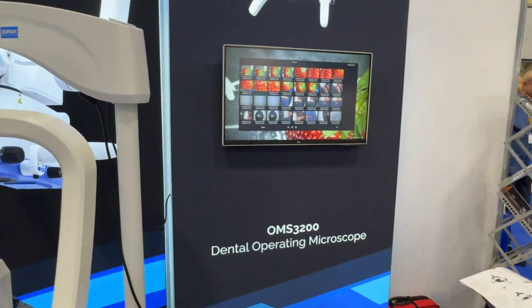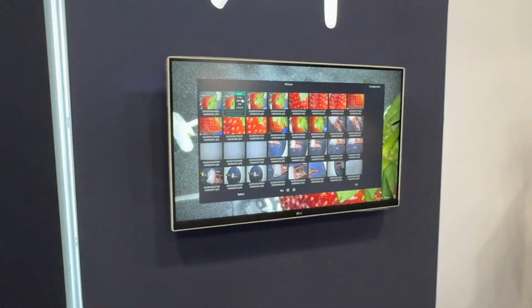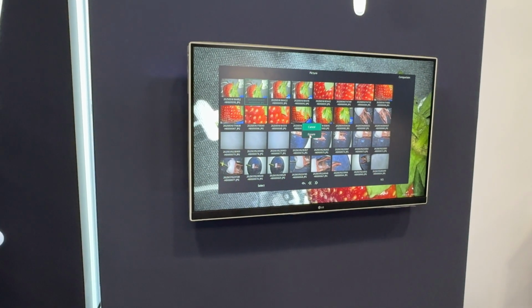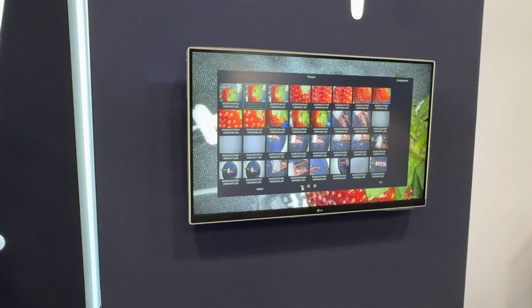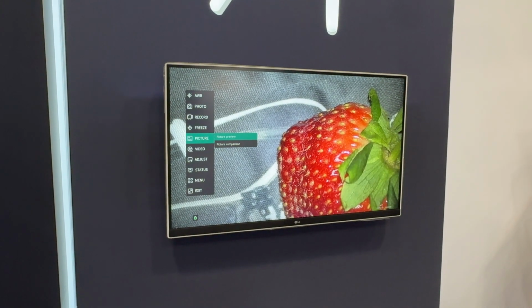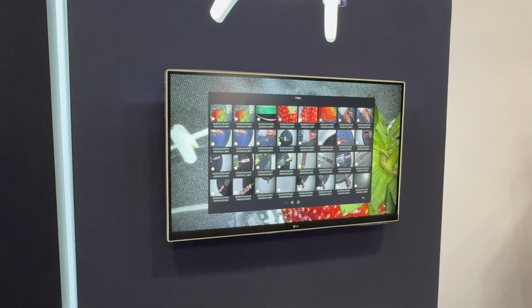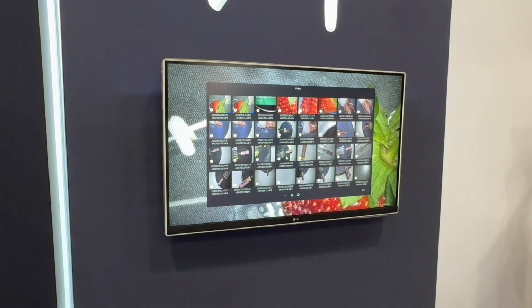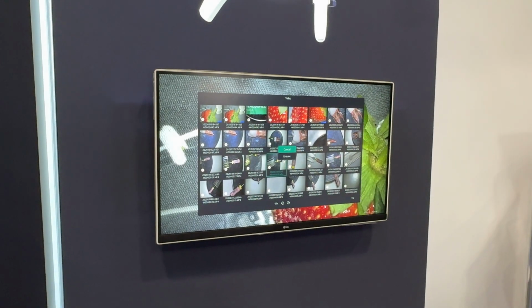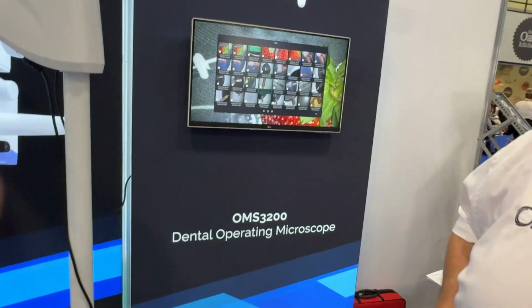And the other thing that you can do on there, if you go onto a picture and left click it, it brings up that menu where you can then delete those images. Depending on how much memory you've got in your flash drive, if it runs out of memory, my tip is just go straight back to the videos. The videos take up more memory than anything else. Find a video you don't like, left click it, and delete the video, and that'll free up a load of space, which you can then take lots more photos on.